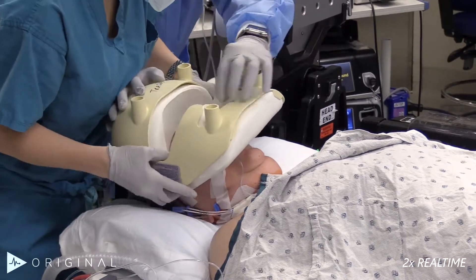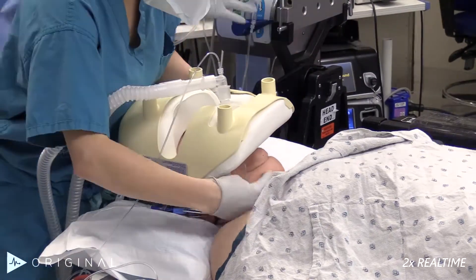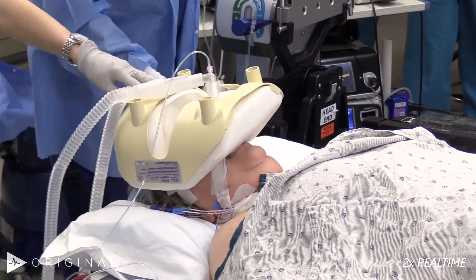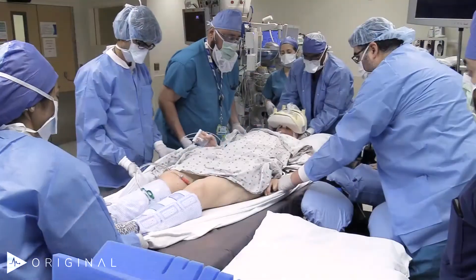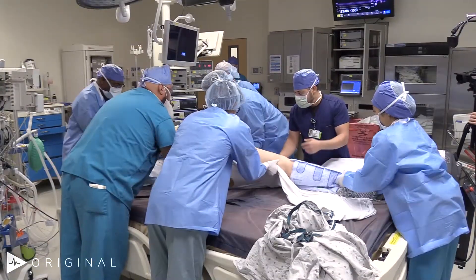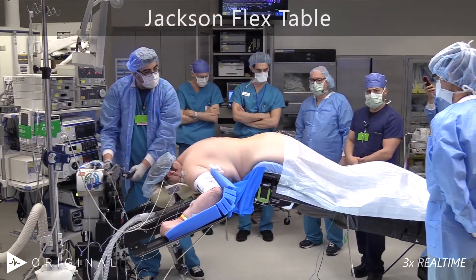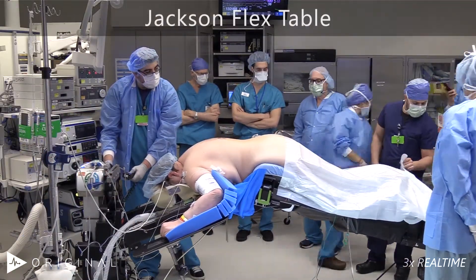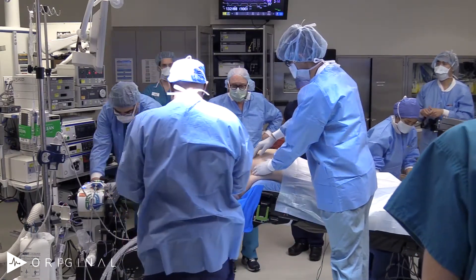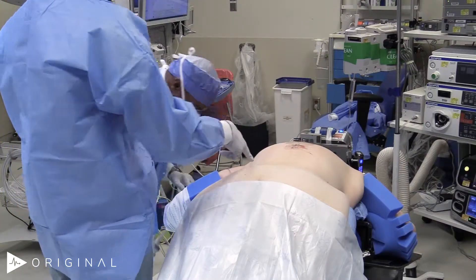Okay, ladies and gentlemen, let's move into position to roll her over now. We want to kind of move her toward the bed first. You could actually lower the foot just a little bit more just so it's semi-level. We'll wrap the arms and we're good to go.